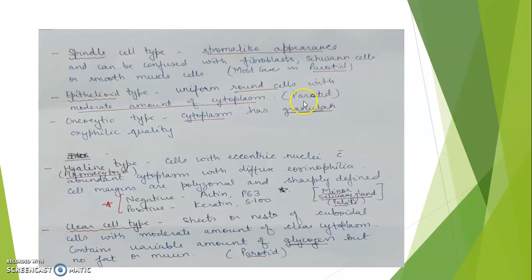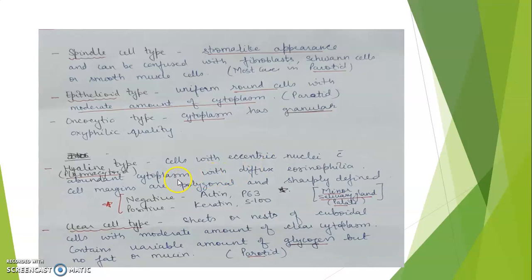The oncocytic type features cytoplasm with a granular oxyphilic quality. In the hyaline type, also known as plasmacytoid type, the cells have eccentric nuclei and abundant cytoplasm with diffuse eosinophilia; cell margins are polygonal and sharply defined. In contrast, the oncocytic type has granular cytoplasm while the hyaline type shows diffuse eosinophilia.